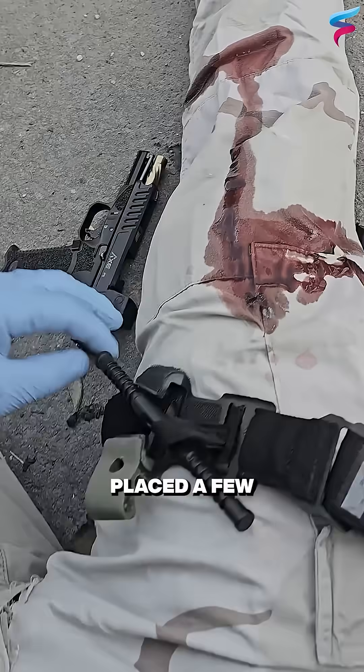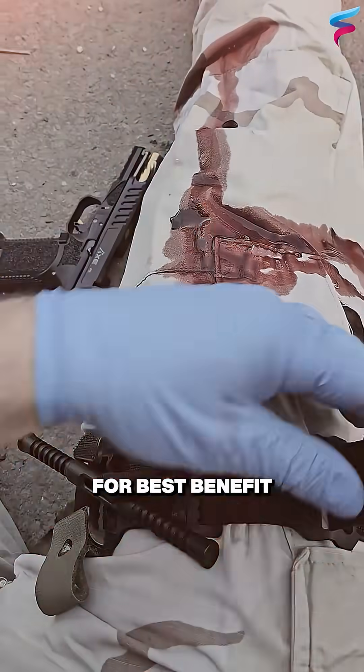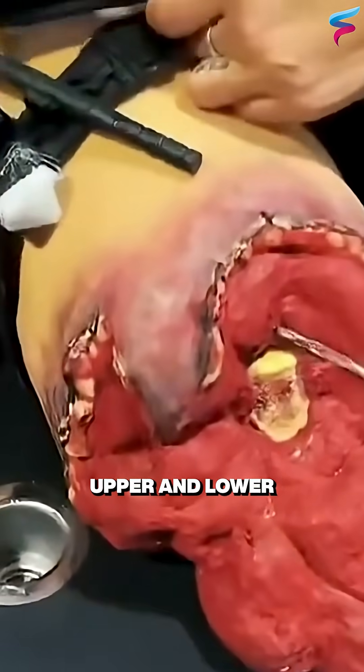The tourniquet is placed a few inches above the wound and not directly on it for best benefit. It should never be placed on the abdomen, neck, or head. It is always suitable to place a tourniquet on the limbs — the upper and lower limbs.